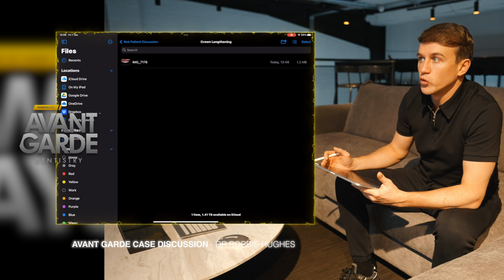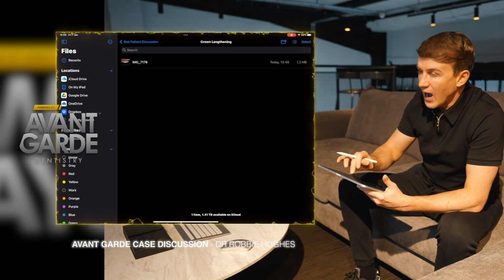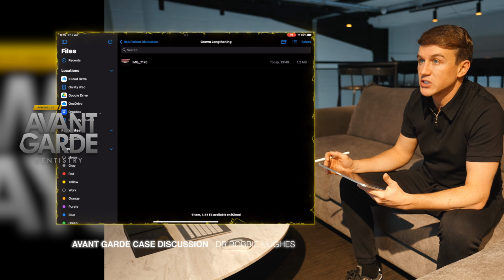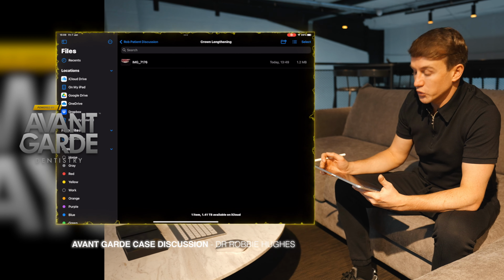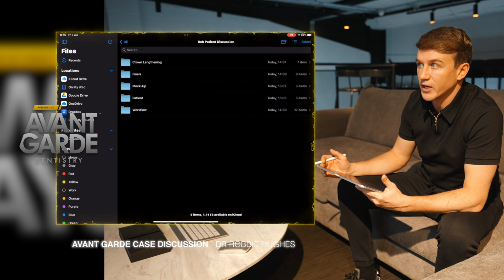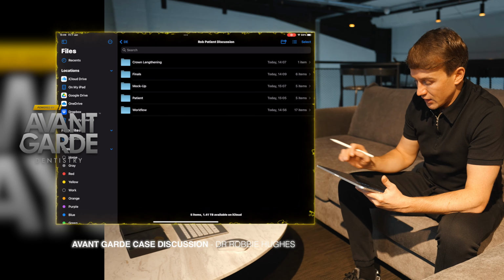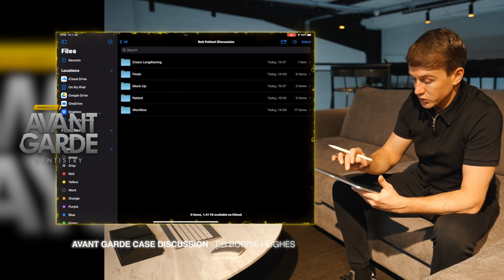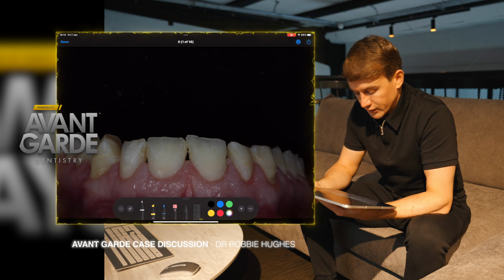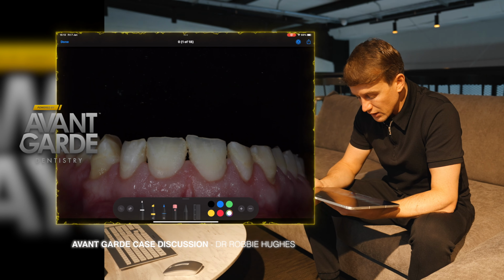This final design will be adapted to the new gingival position. And then we have a nice accurate stent created, which we'll show you in a sec with the workflow, which is going to allow us to create these veneers really accurately with nice margins and really good adhesion to the tooth. So the day of treatment execution for the injection mold technique is how the patient presented.